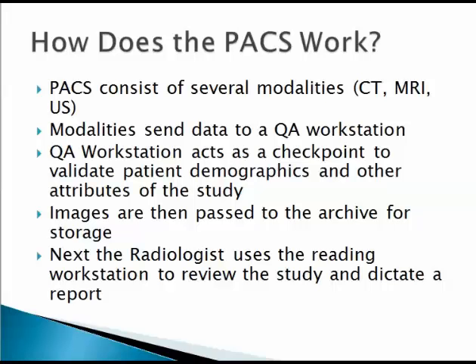A PACS consists of several modalities. As I mentioned, CTs, MRIs, ultrasounds. Once the image is taken, the modality sends the data to a QA workstation. The QA workstation acts as a checkpoint to validate patient demographics and other attributes of the study. The images are then passed to the archive or server for storage.